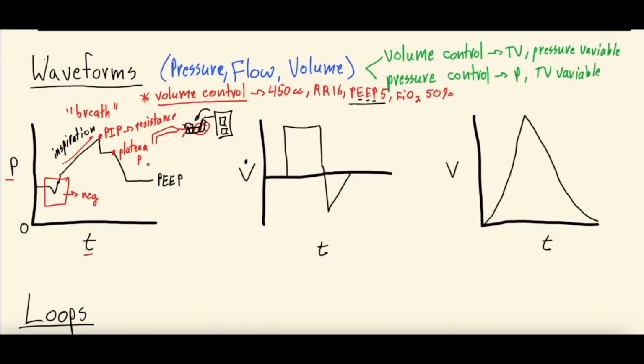And a plateau pressure is after the breath is pushed fully in, so picture the ventilator pushing that breath in, you then pause at that maximal amount of tidal volume. And the plateau pressure is this plateau that you'll see, which is representative primarily of the compliance of the lungs. Some other things contribute as well, such as how heavy the chest wall is and those types of things, which is out of the scope of this video discussion, but this would be the plateau pressure.